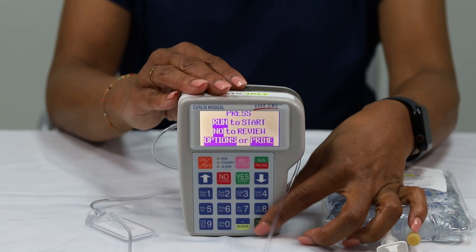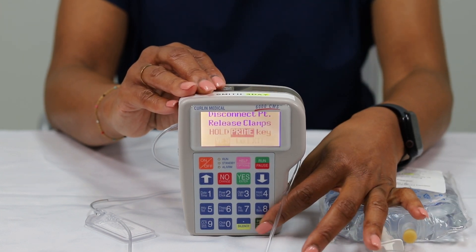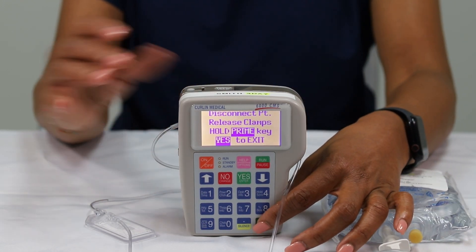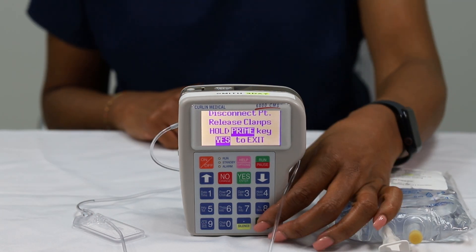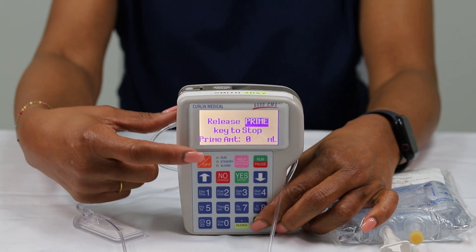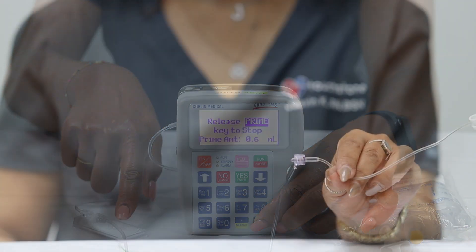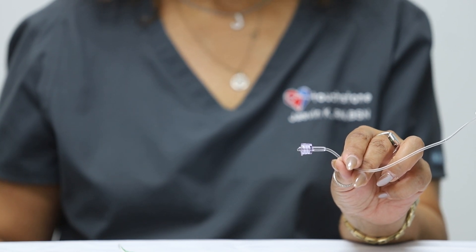Now you are ready to prime your IV line. Press the dark green prime/bolus button once, located at the bottom right corner of the keypad. Please make sure to loosen the blue cap at the end of the line to allow air to exit the tubing, and that the white air filter is flat down on a smooth surface. Now press down and hold the dark green prime/bolus button. You must continue to hold down on the button to remove all the air out of the line. This normally takes about five to seven milliliters. When the line is primed, you will see a few drops come out of the end of the line.